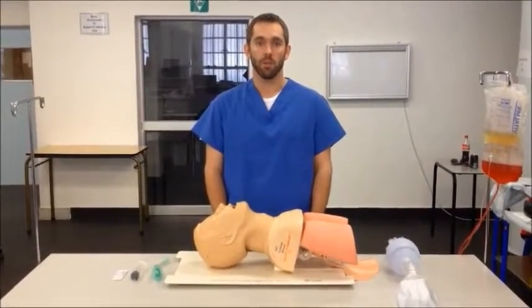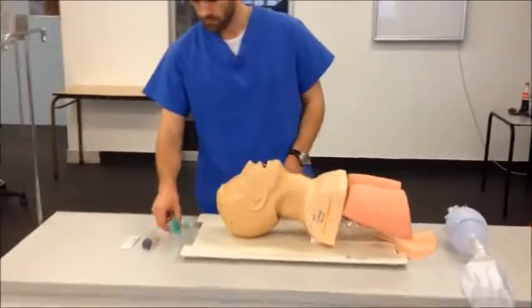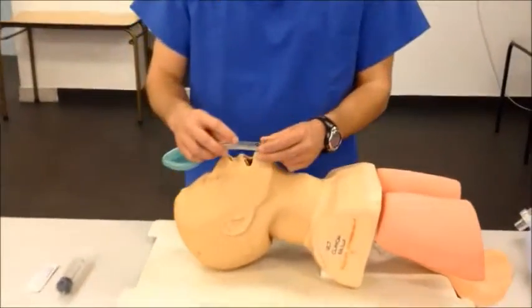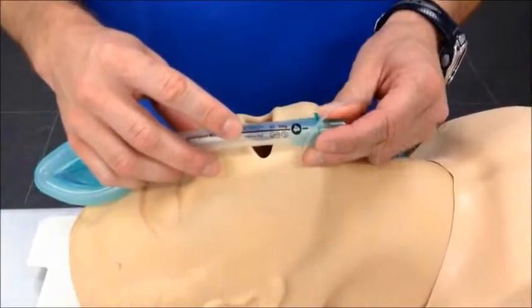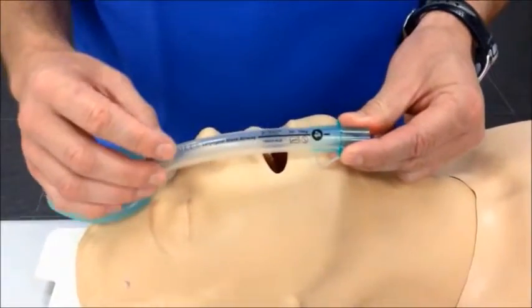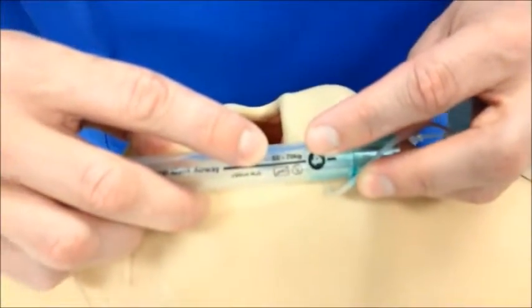The first step in using an LMA correctly is to select the correct size. Sizing of laryngeal mask airways are manufacturer specific, and the instructions will usually be printed on the tube itself. In this case, we can see that it would be appropriate for an adult weighing between the above.